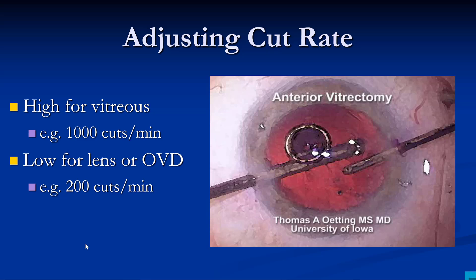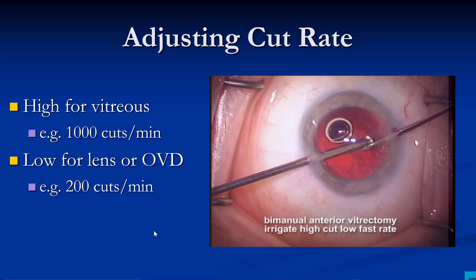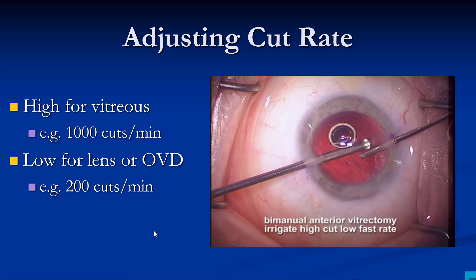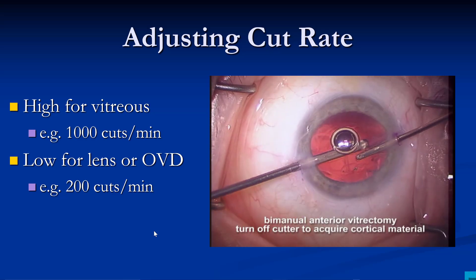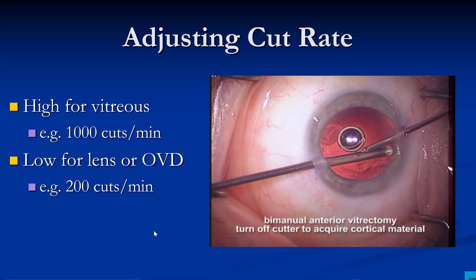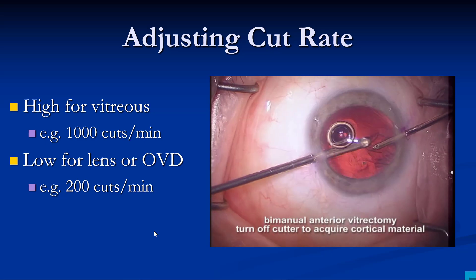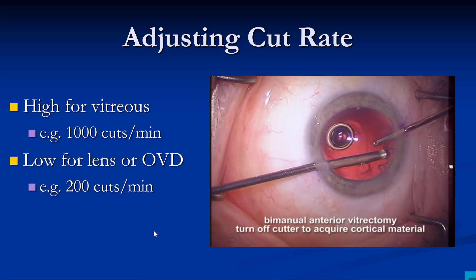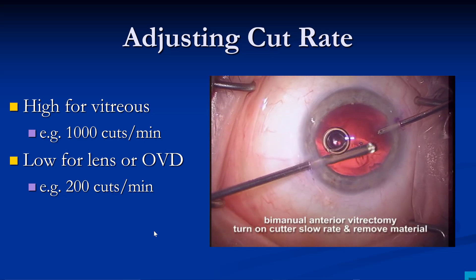The cut rate for this work is fairly simple. When doing vitreous work, you want the cut rate as high as possible. When doing lens work, you want the cut rate lower. Sometimes you'll turn off the cutter if you want to grab some residual material — go out, grab some material, pull it in. We've got a lower cut rate because we're working on lens material, but once we bring it to the center where vitreous may be present, we turn the cutter on. Turn the cutter off on the periphery to preserve capsular remnants, bring material to the center, then turn the cutter back on.